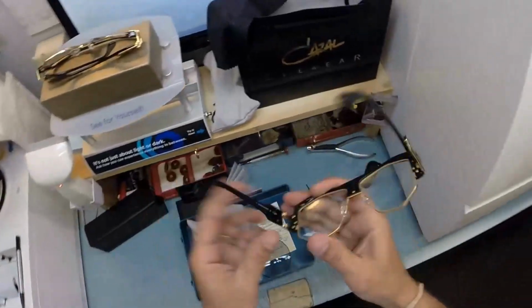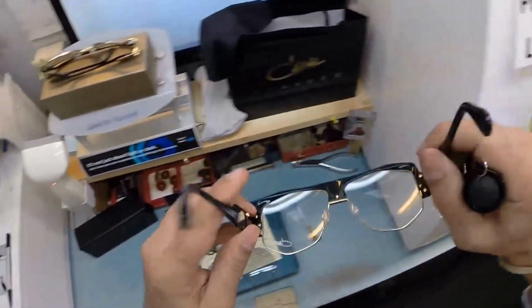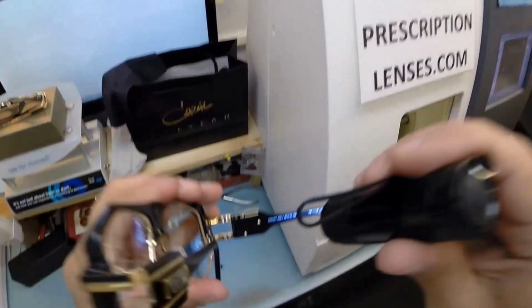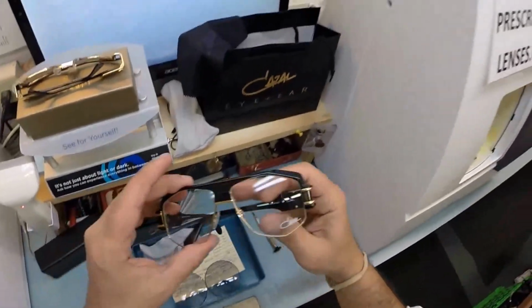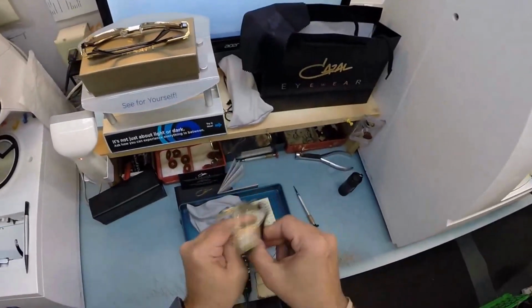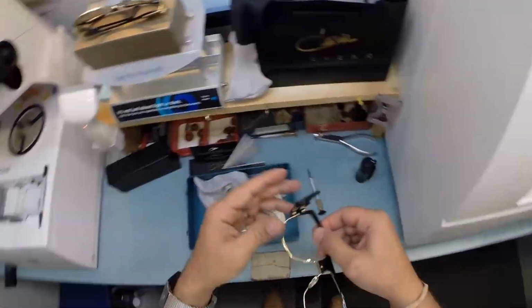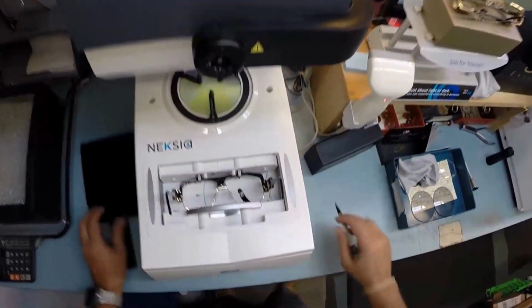So, again, this is the Cazal, of course, made in Germany. Again, as I mentioned before, the model 671 color 1 and the 59 eye size, 13 bridge, and 135 temple. So let's go ahead and begin. I'm going to take out your original demo lenses, one of which says Cazal. And of course, you're going to be receiving all the manufacturer's original packaging to know you got the real deal. But I'm going to take this out, put it into the tracing element of my edger, and hit start.